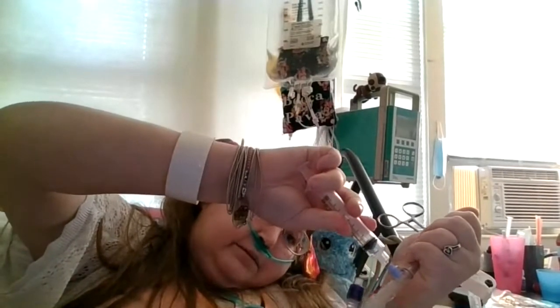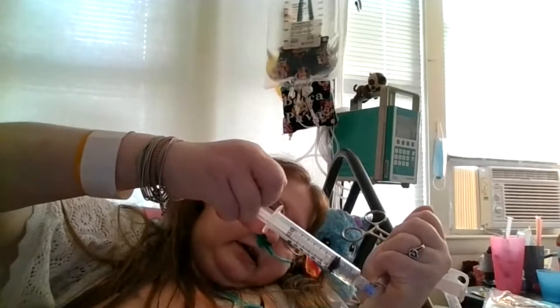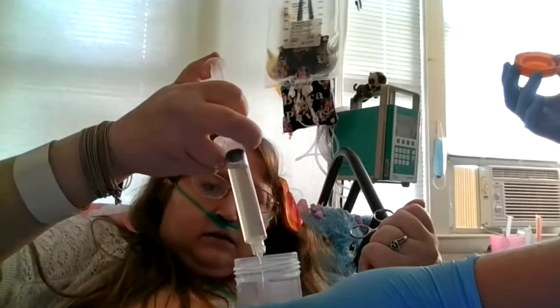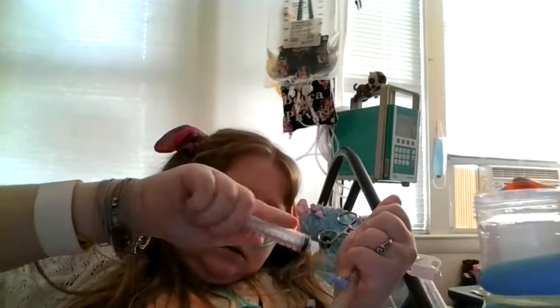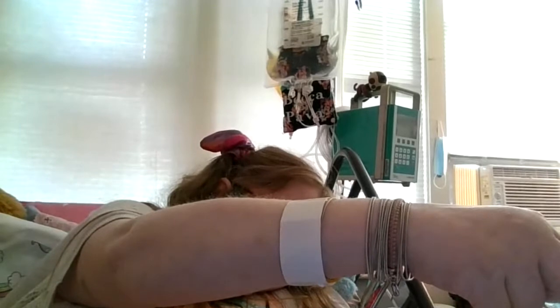I'm going to go back in for some more urine. Getting more - still really cloudy. I see a bunch of floaties in there - a lot of floaties, a lot of pus. I'll probably go in for one more syringe full; the more they have the better so they can work with it. My urine supply is running dry though - yeah, that's definitely enough, you've got a ton of floaties.